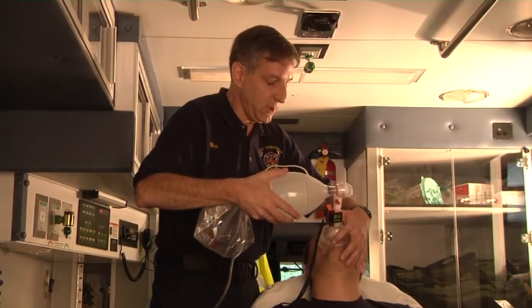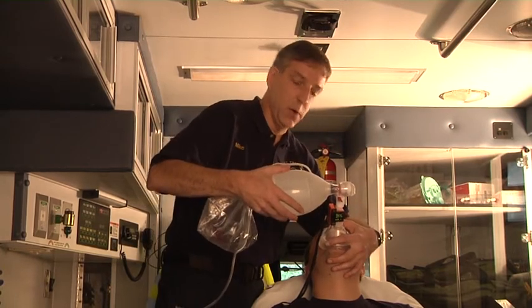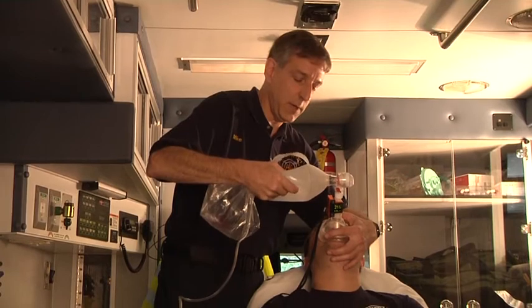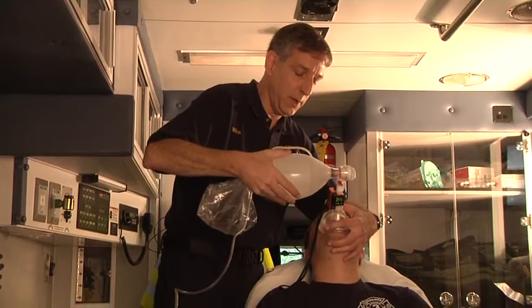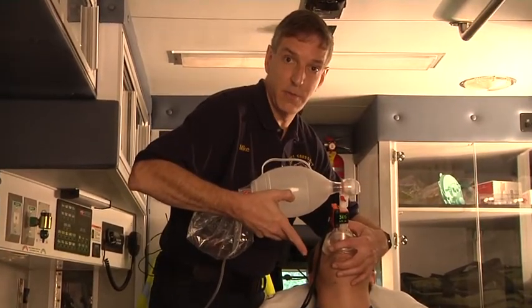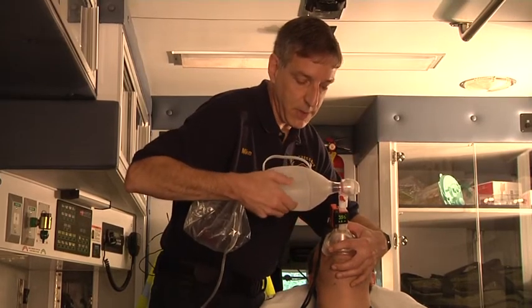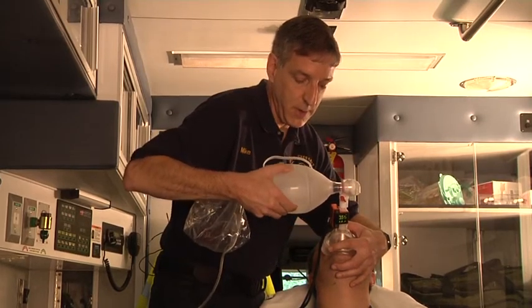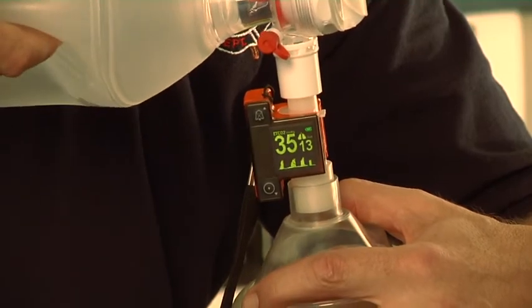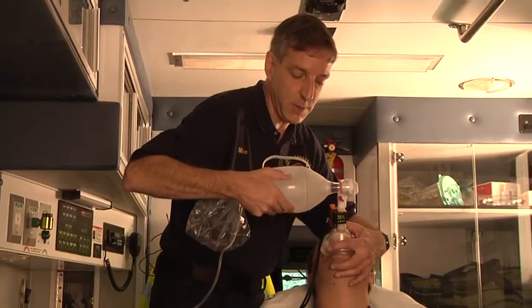If we were going to assist the patient with ventilations, we're going to squeeze the bag to place air into the patient and we could watch the patient's chest. That's the best feedback mechanism — to actually watch the patient's chest. When the patient goes to take a breath, you squeeze some extra air in to enhance the breath that the patient's taking.